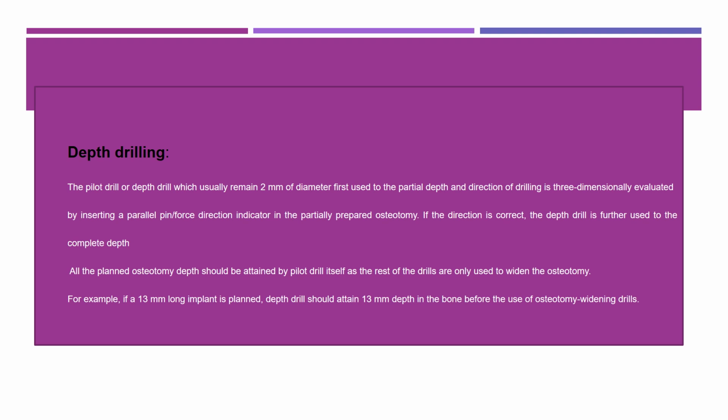Then the widening of the osteotomy with drills. A surgical guide always helps you check for proper positioning and directs the proper implant placement throughout the procedure.